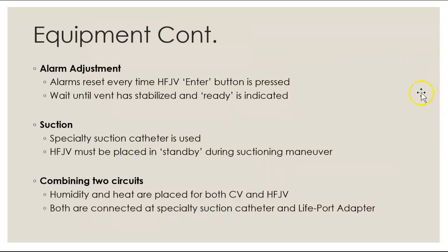Probably as much as this is one of my most favorite pieces of equipment, the alarms drive me nutty. And that's because every time you press the enter button, it resets the alarms. So if you make a ventilator change, or start it back up after pausing the ventilator, it always adjusts the alarms, so you have to reset them every time.